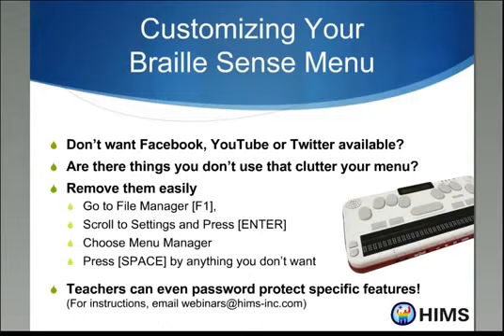Now there is a way to password protect this, and we do not have it documented because we really don't want students to have access to it so that they don't go around password protecting each other's BrailleSenses and just making their friends' lives difficult. But if you will send us an email to webinars@hims-inc.com, we will be more than happy to send you the information on how to password protect the items once you've locked them out.